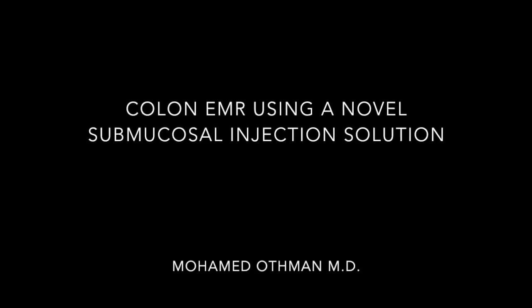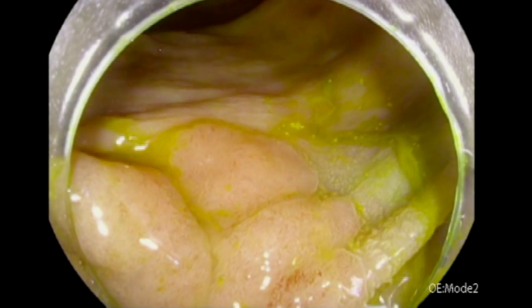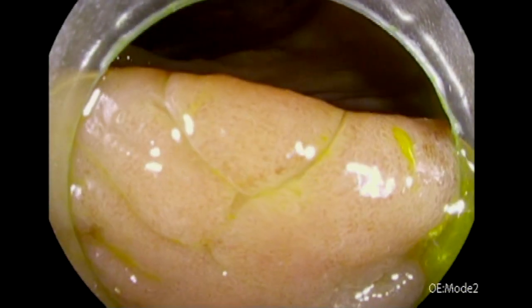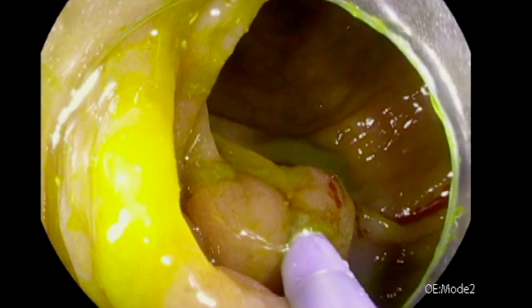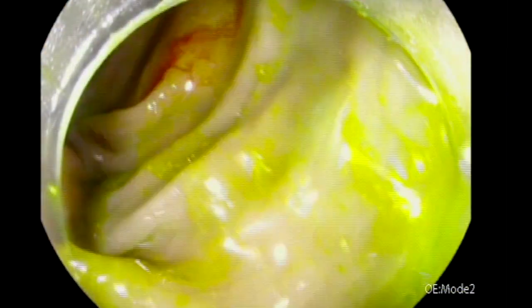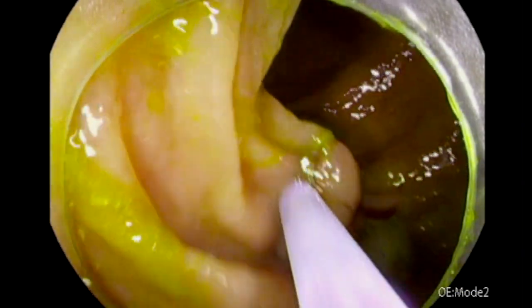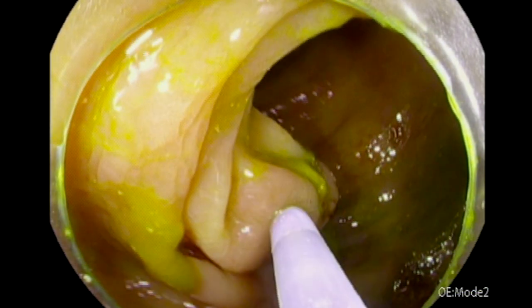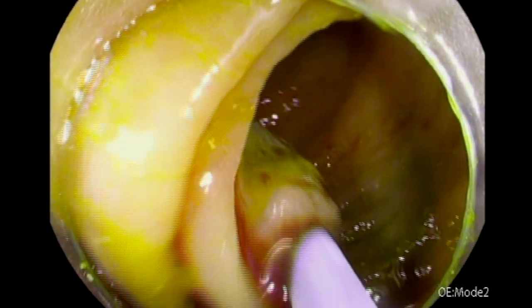Hi, this is Mohamed Atman and today we have a new EMR video. I've been posting a lot of ESDs recently, but I thought to go back to EMR because in this video I'm using a new novel submucosal injection agent called L-View. It's a combination of methylene blue and other proprietary volume expander material that helps elevate the lesion for a longer period of time.